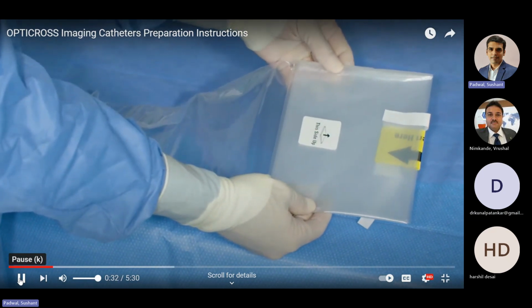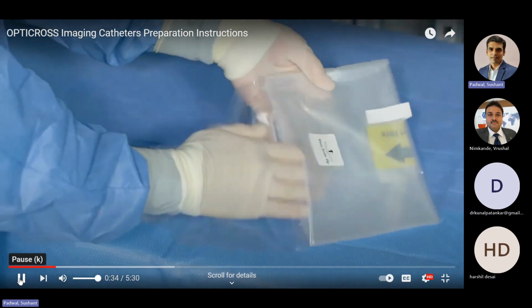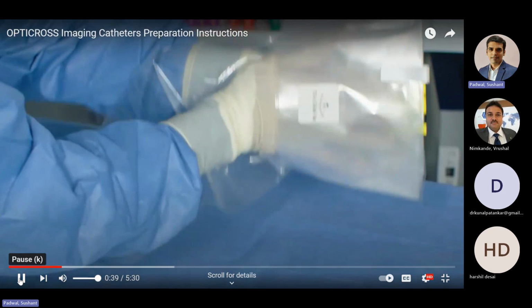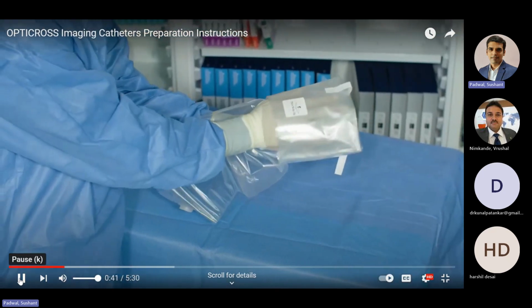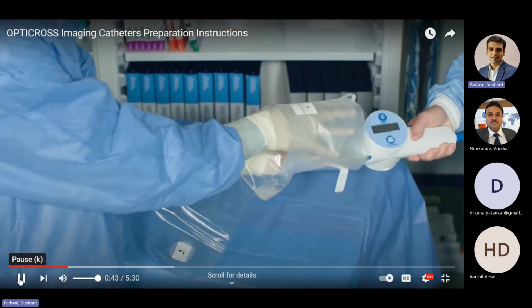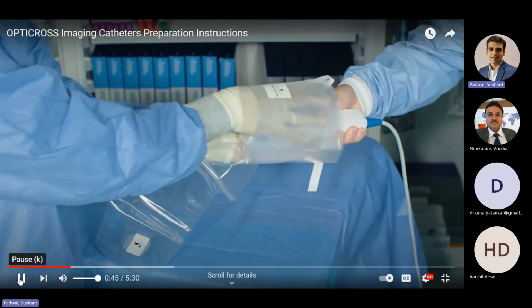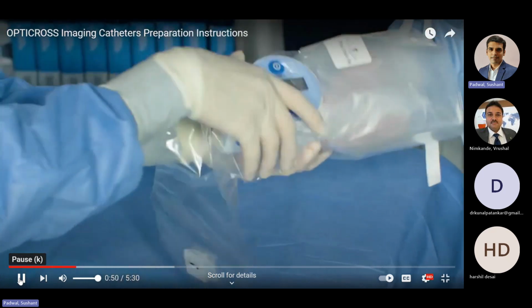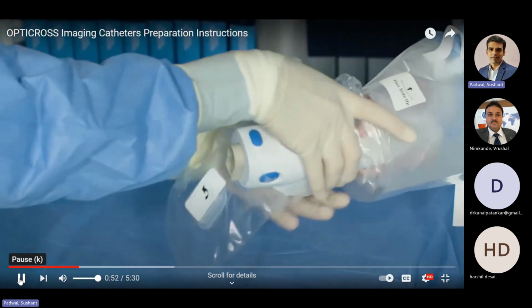Ensure the This Side Up sticker is facing the ceiling. The sterile field operator will place hands into the innermost folds of the bag and open the bag for the motor drive to be inserted. The non-sterile field operator will place the motor drive into the opening of the bag with the faceplate pointed up.